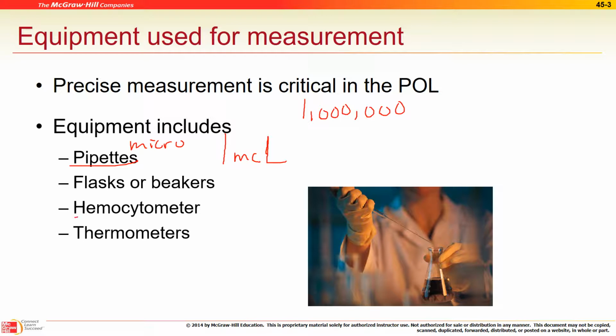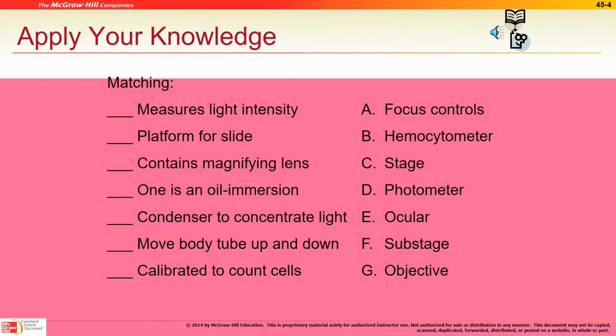It's tiny. We're measuring blood cells with a cell counter, and then here we're just measuring heat. So just simple thermometers, and even the forehead scanning ones you'll use.